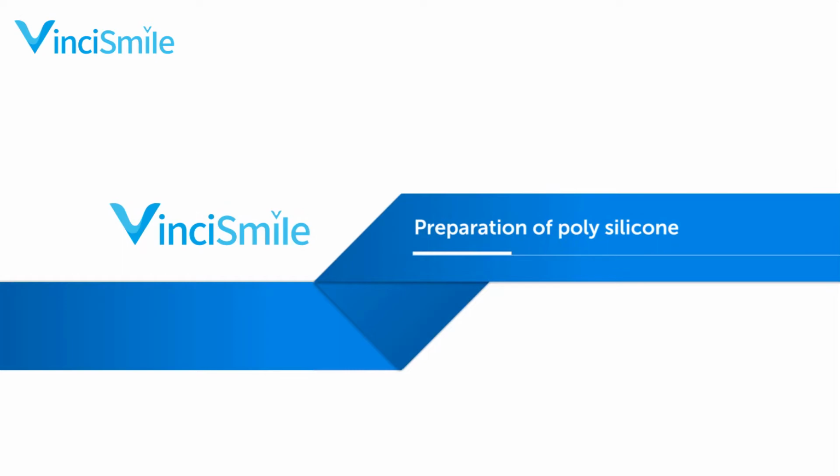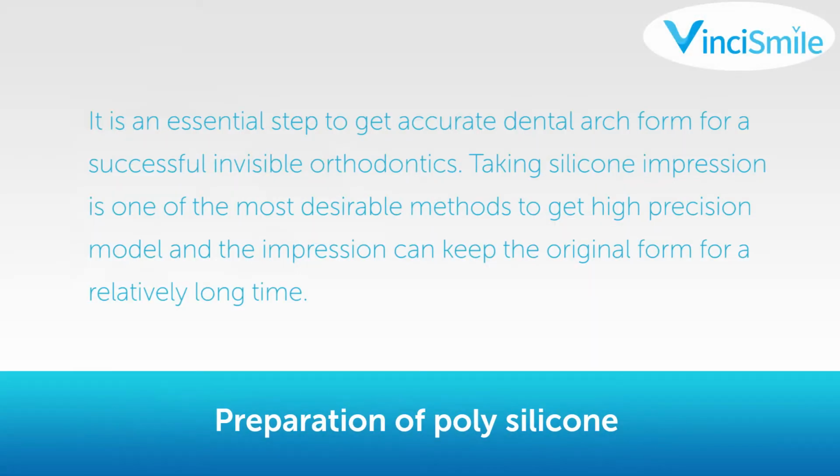Preparation of polysilicone. It is an essential step to get accurate dental arch form for successful invisible orthodontics. Taking silicone impression is one of the most desirable methods to get a high-precision model, and the impression can keep the original form for a relatively long time.